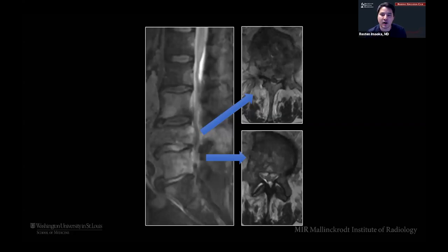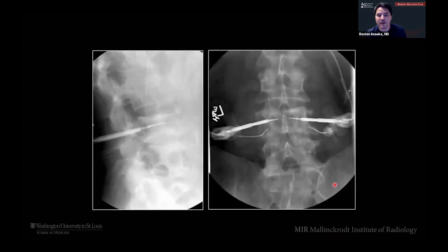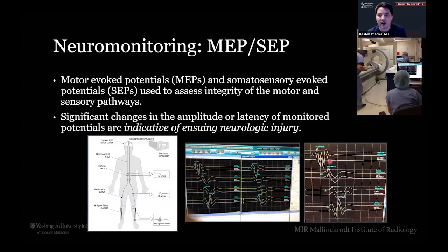So here's an example of a thermocouple, right? This is a patient who got RFA of his L4 and L5. You can see this is that epidural example there. These are the ablation probes coming in through the pedicles here. And then these little things down here are the temperature sensors, right? So that's sitting in the foramen. You're measuring the temperature there next to the nerves to know how close you are getting to that 44 degrees, and whether or not you've got to give them a break. We usually would only do this if they're under GA. Usually we prefer the biofeedback for RFA.